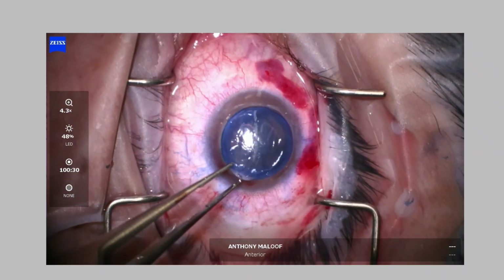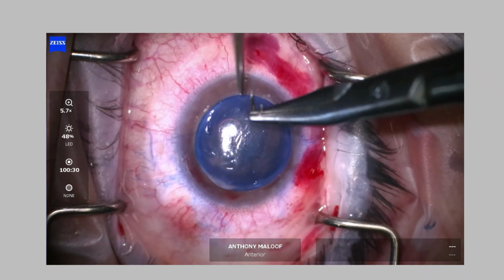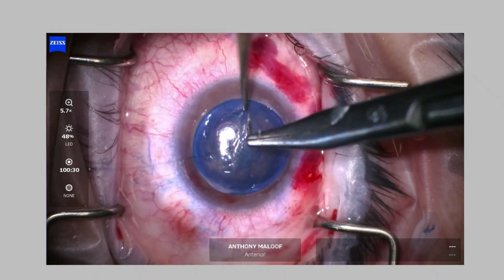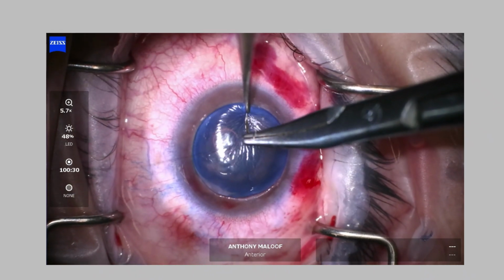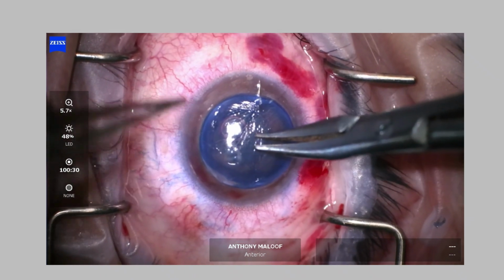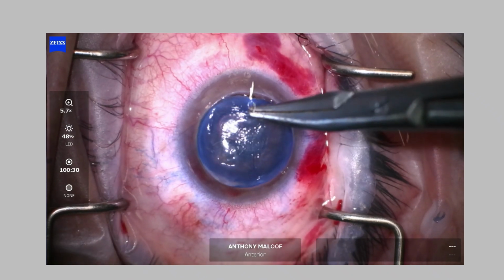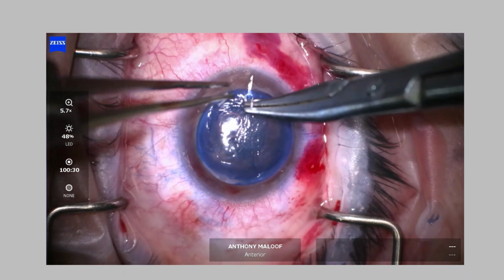Slight oversizing, as I said. I always use cardinal sutures. These are removable sutures. I don't leave cardinals in place. I use 8 routinely, not 4. I was taught to use 4, but I always use 8, and I make sure that it's sitting as I want. This is one of the huge advantages of a stromal transplant.